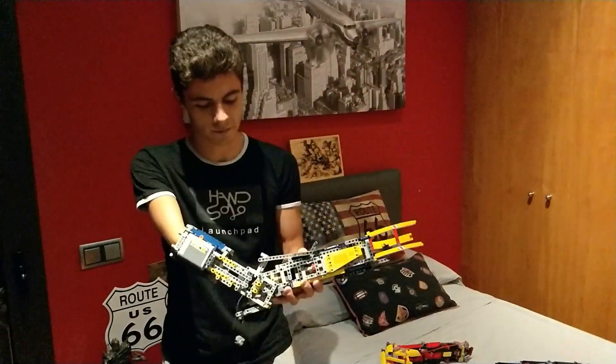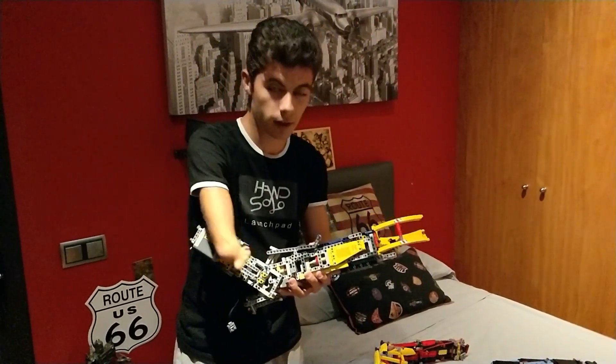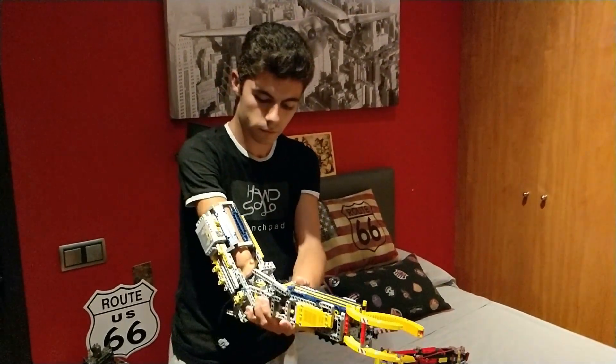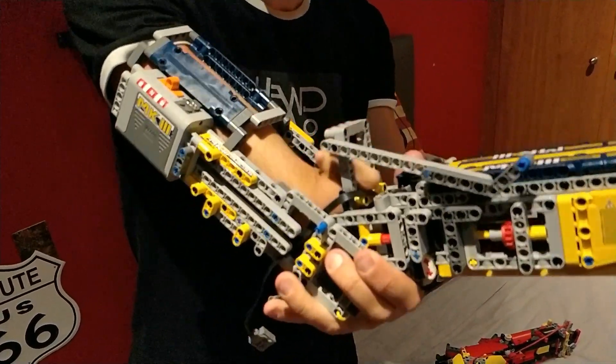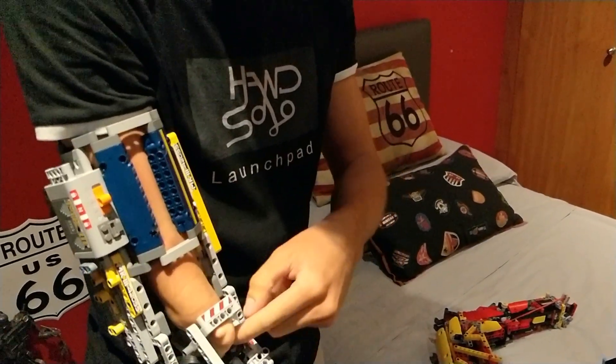But now, I will show you my new MK3. It's completely different from the others. I will show you how we put it. My hand, in this position. A little bit like this. Very simple.